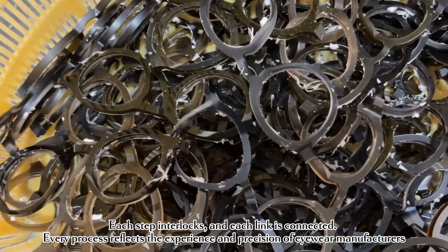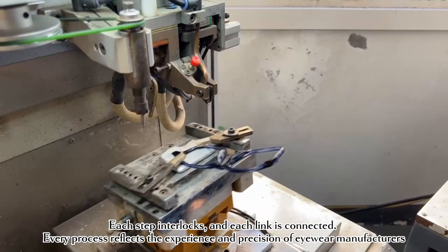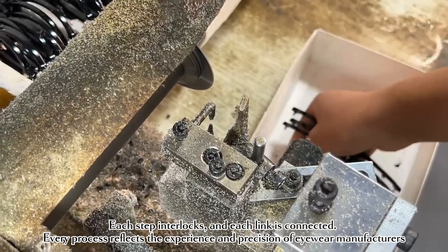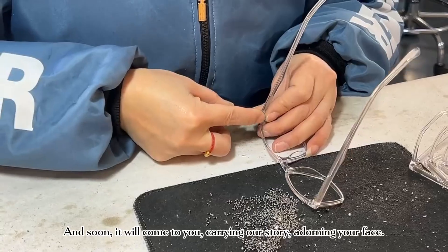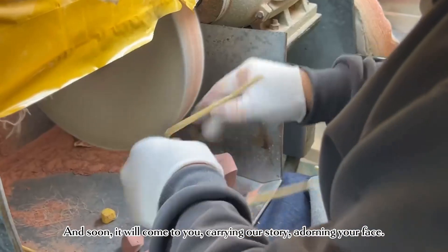Each step interlocks and each link is connected. Every process reflects the experience and precision of eyewear manufacturers. Soon it will come to you, carrying our story and adorning your face.